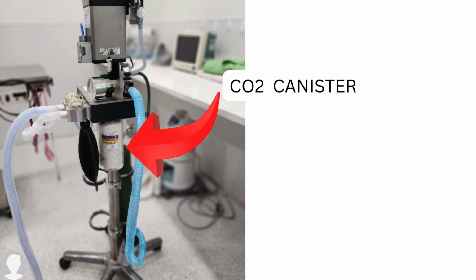The CO2 canister is a white pellet that will filter CO2 from the anesthesia machine. It should be replaced after 10 hours of use. It can turn purple, but it may go back to white after each use. Another way to check if it's exhausted is that when you try to crush it with your fingers, the pellet should go into a powder easily. When the pellet is exhausted, it turns very hard.